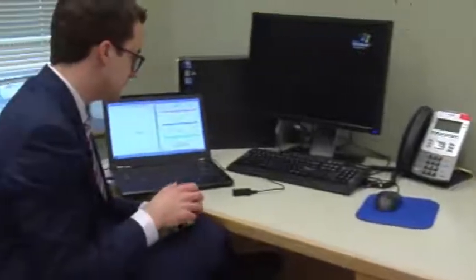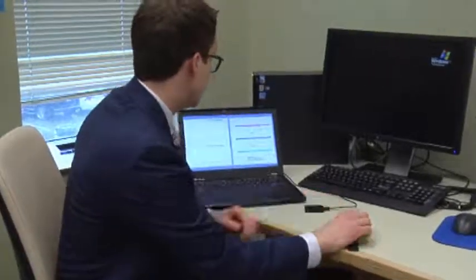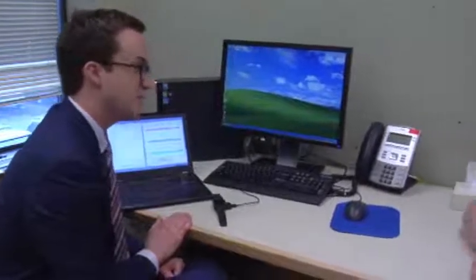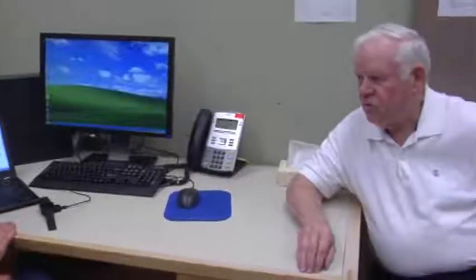As part of a clinic visit, you can collect data in less than 5 minutes at the end of the visit. And then that can be used for a number of things. So it could be used to track how well treatment is working. It can be used potentially in diagnostically difficult situations where you're not sure if people have one kind of tremor or another. And potentially down the road, if it's easy enough for patients to use, they could actually collect the data themselves at home and send it over the wireless network to the doctor.